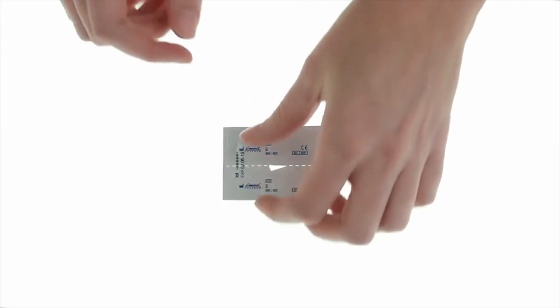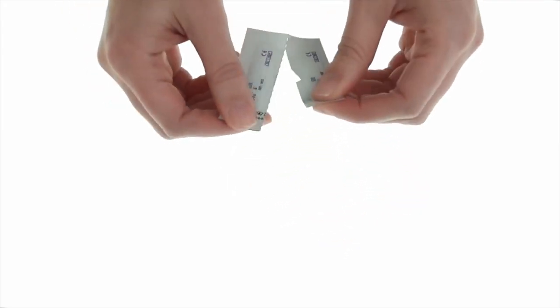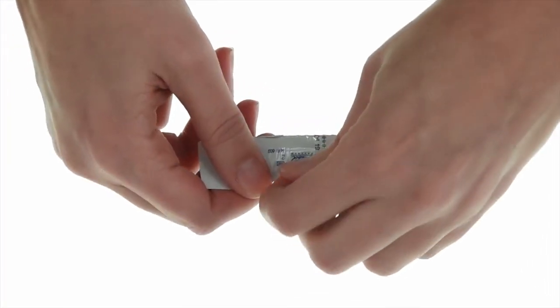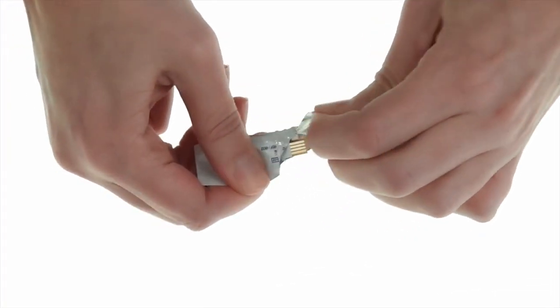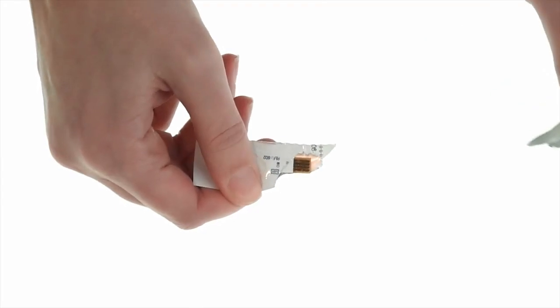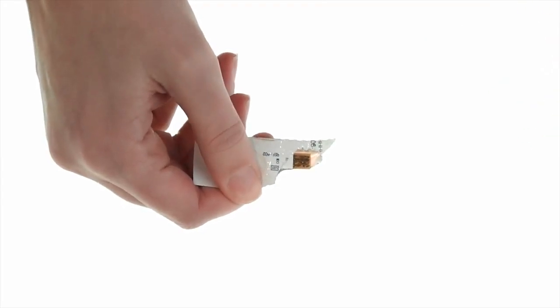To start, remove one single-use sensor from its packaging. Tear along the dotted line to separate one of the attached wrapped sensors. Grasp the bottom of the package firmly with one hand and carefully tear in the direction of the pre-cut section to expose the end of the sensor to be inserted into the iPen device.